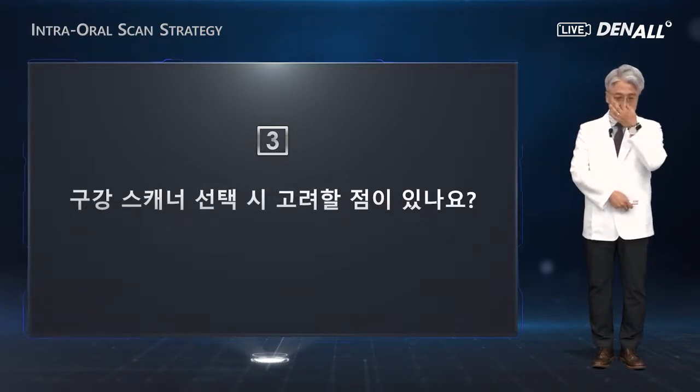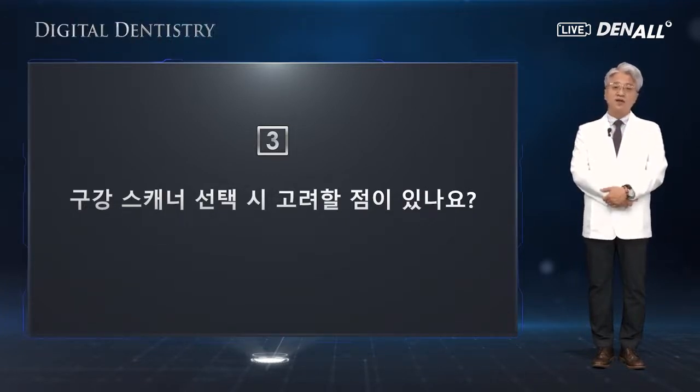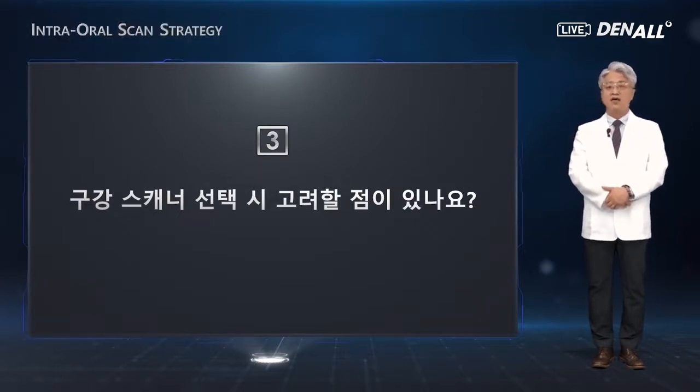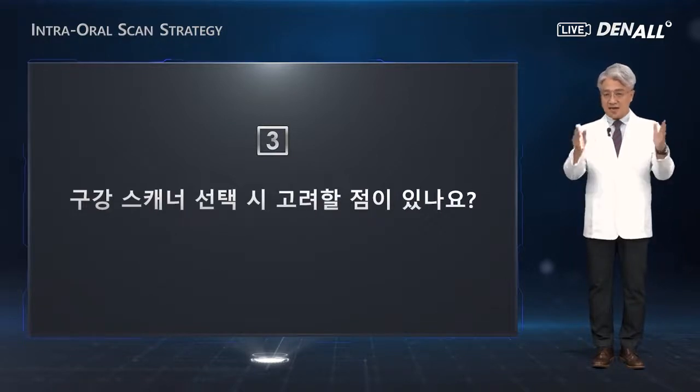In applying the scanner clinically, the tip size is important. If the scanner tip size is very large, it is difficult to scan in the posterior region or the adjacent contact region between teeth. Therefore, it is better to have a small scan tip size.